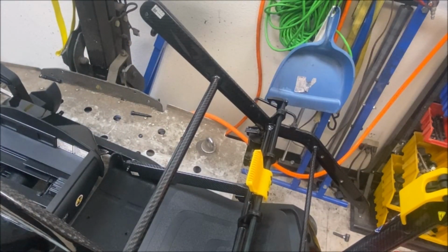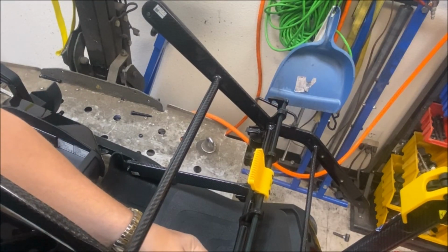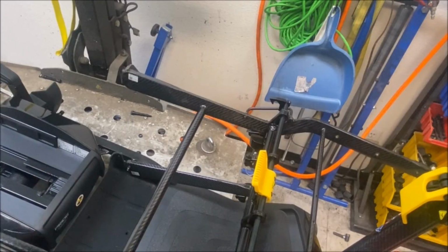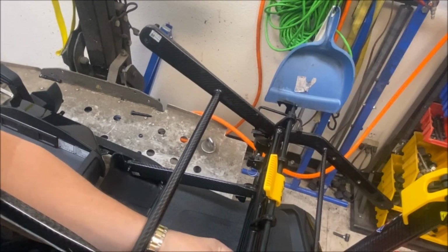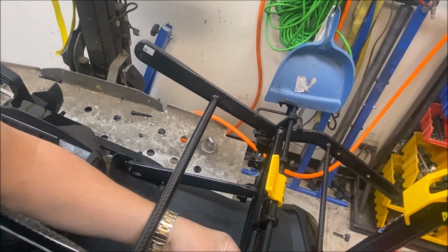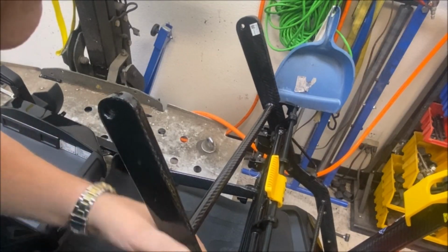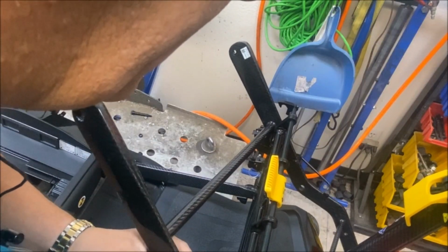Let's get this left side off. They're not super tight, so don't over tighten them or you're going to restrict the fold. Too tight and you'll cause problems. Don't want to lose it. Inserts.